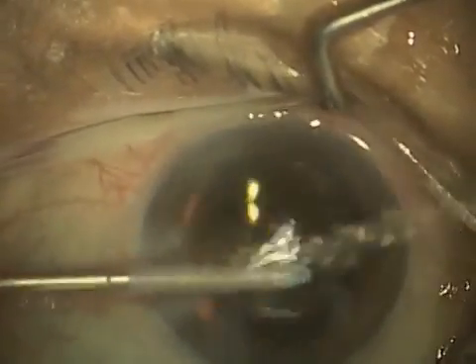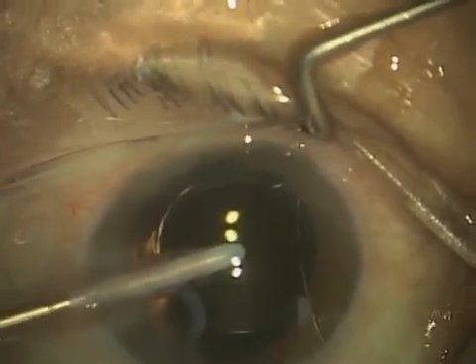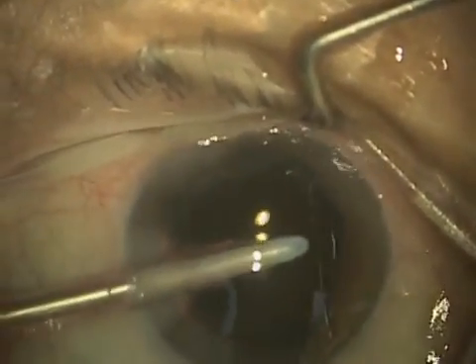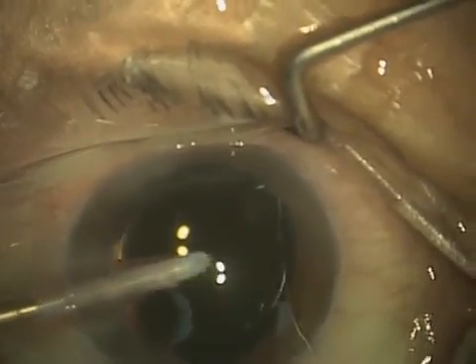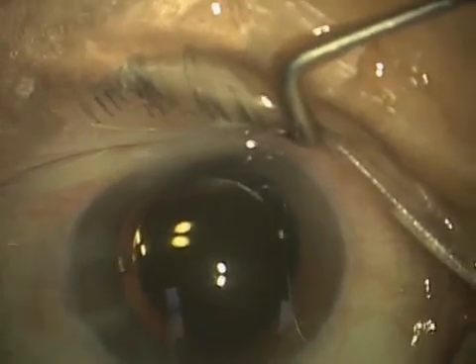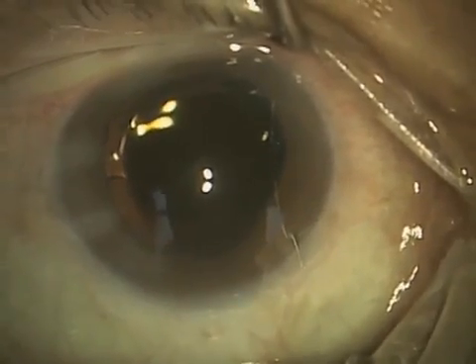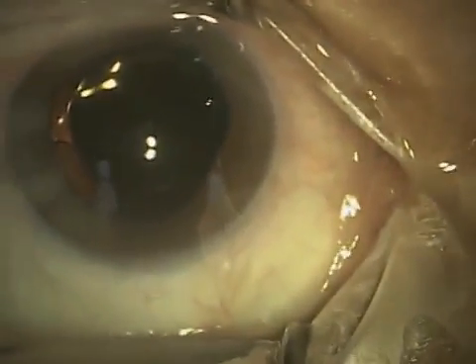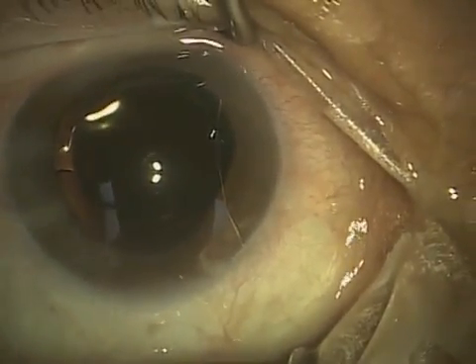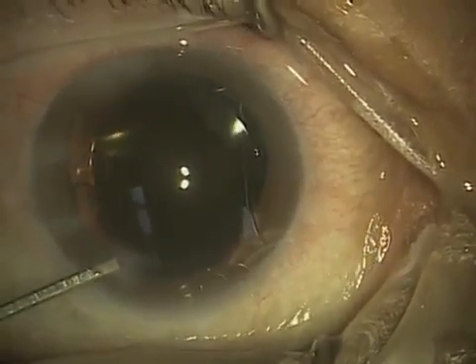Right there you saw I actually took the handpiece and placed the tip behind the lens to remove the viscoelastic that's behind there. Again, not everybody does that because you're placing the tip near the capsular bag, but my concern is that if that viscoelastic is not removed from behind the lens and it's trapped, then you can get a pressure spike, which can put the optic nerve at risk. So as with most things in medicine, it's a matter of weighing the risks versus benefits. In my hands, I think the benefit of removing the viscoelastic from behind the lens is worth doing.